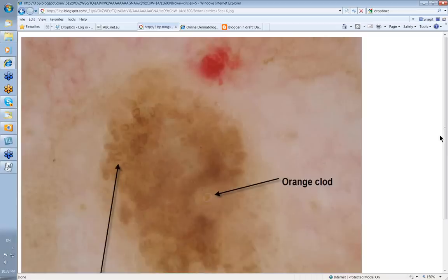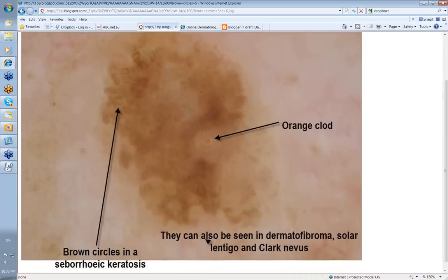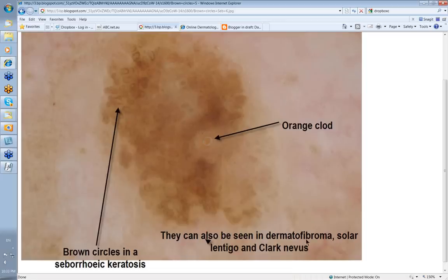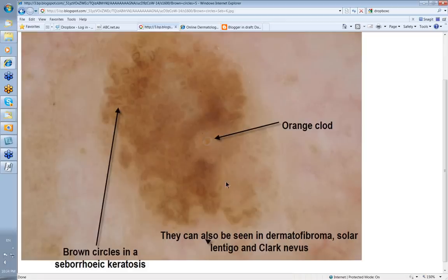Let's look at some brown circles. These are the brown circles here in this lesion, and here you've got an orange clod. Orange clods are particularly commonly seen in seborrheic keratosis, and brown circles can be part of seborrheic keratosis as well. But remember, brown circles can also be seen in dermatofibromas, solar lentigos, and Clark nevi. Usually in a dermatofibroma the brown circles are joined up as lines reticular, though they can sometimes be separated. Generally in a dermatofibroma you'll have thick white collagen in the center with the brown circles around the outside. The presence of the orange clod with the brown circles here makes seborrheic keratosis much more likely.